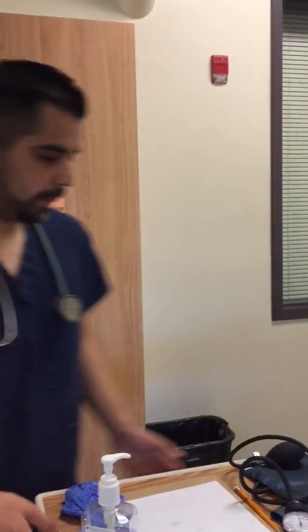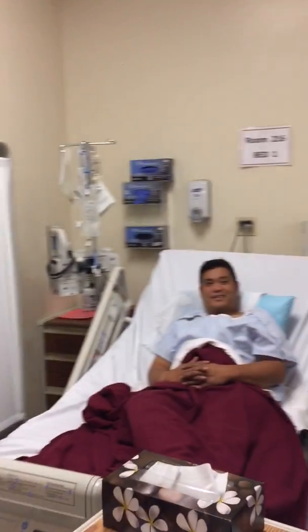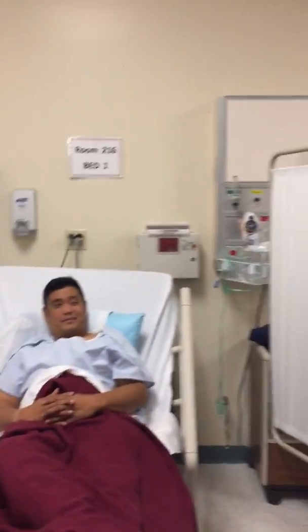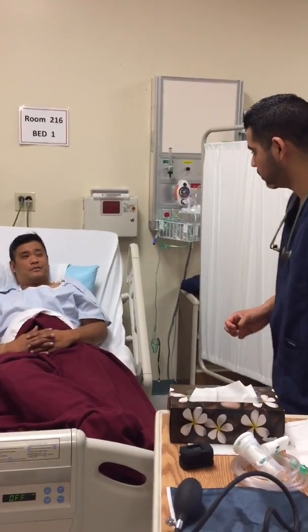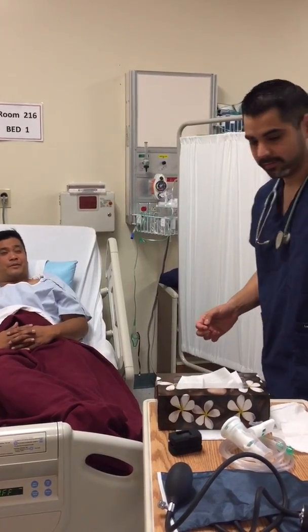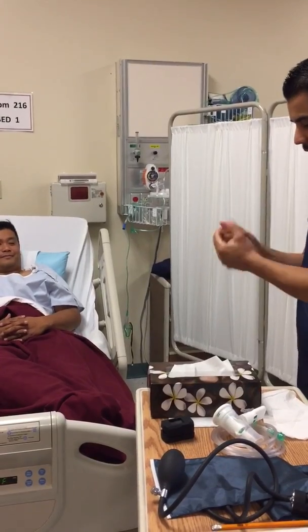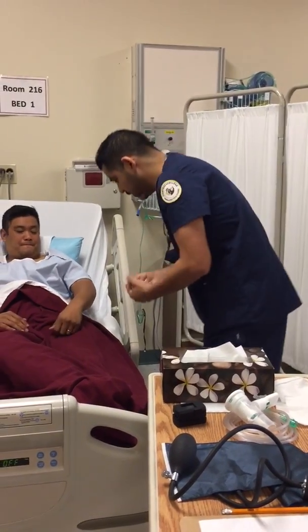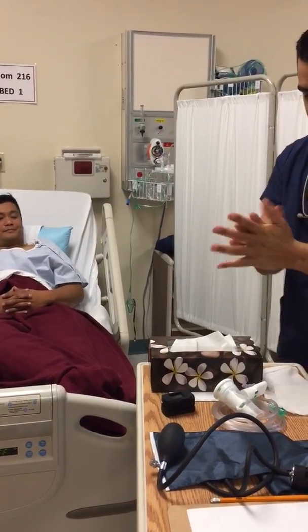Hello. Hello, Mr. Lota. My name is Christian. I am a respiratory care student from Hartnell College, and may I please have your first and last name, please? It's Richard Lota. Okay. And date of birth? January 3rd, 73. Okay. All right. Let me see your wristband for me, please. Thank you very much. I'll make sure I have the correct patient.